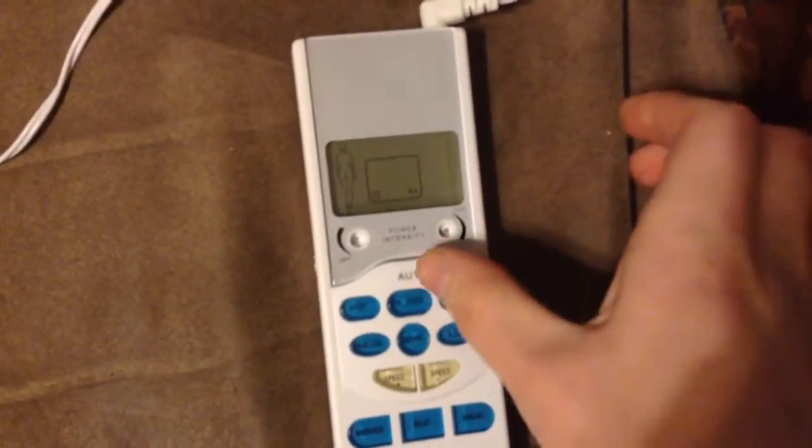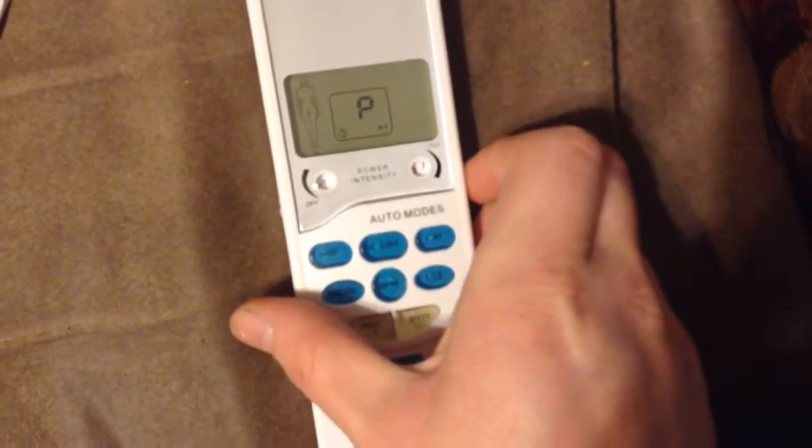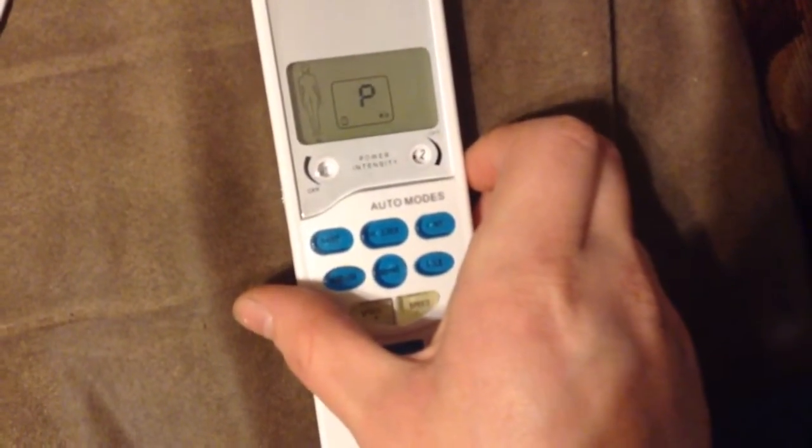So to turn this on, we just go right here and turn it on. I'll do about two first. So I have it hooked up to this hand right there. And we will go with the hand leg.